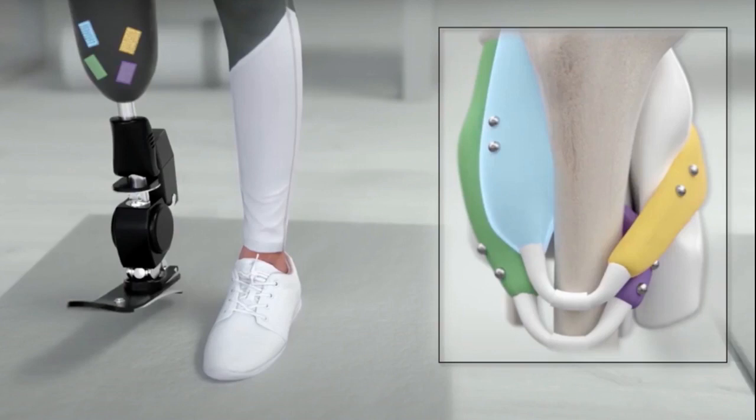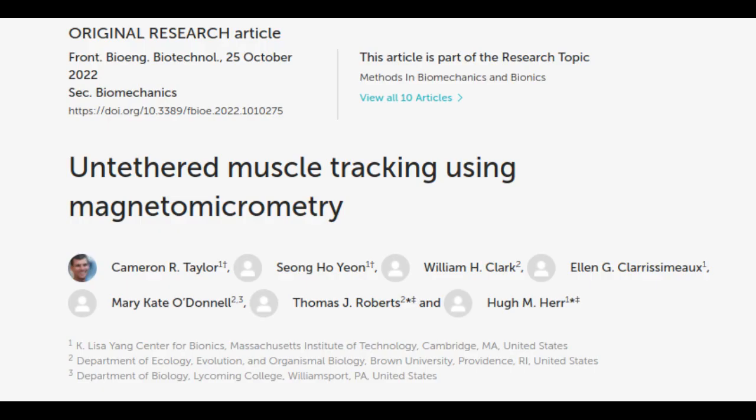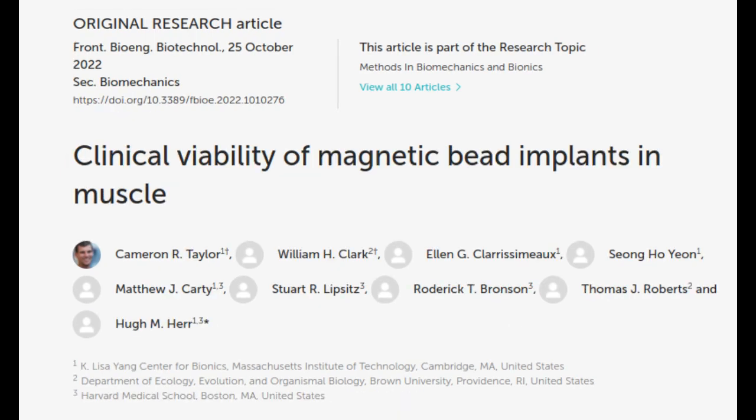These recent results demonstrate that this tool can be used outside the lab to track muscle movement during natural activity, and they also suggest that the magnetic implants are stable and biocompatible and that they don't cause discomfort. In one of the studies, the researchers showed that they could accurately measure the lengths of turkeys' calf muscles as the birds ran, jumped, and performed other natural movements. In the other study, they showed that the small magnetic beads used for the measurements do not cause inflammation or other adverse effects when implanted in muscle.